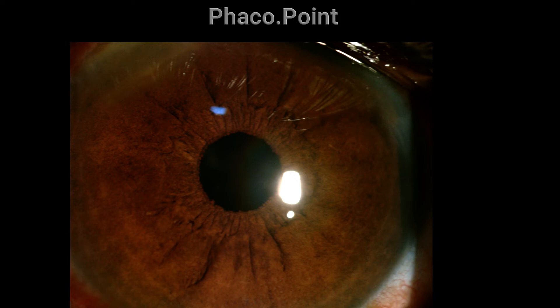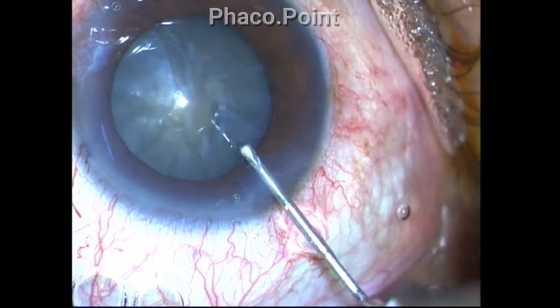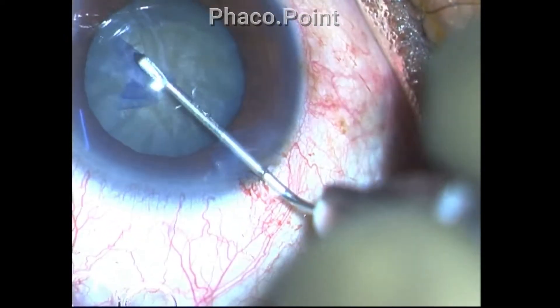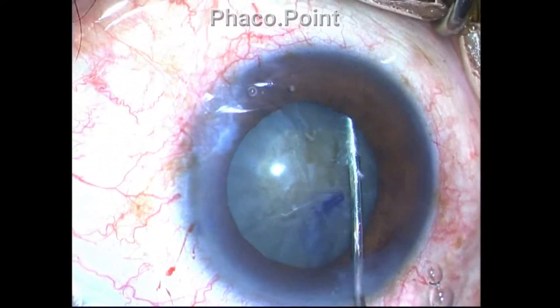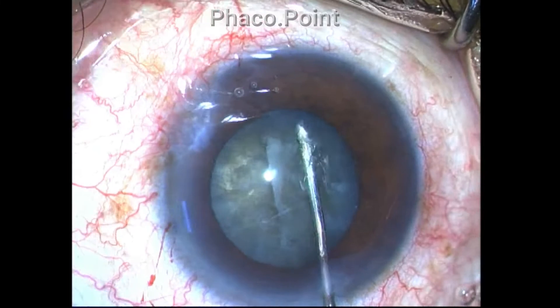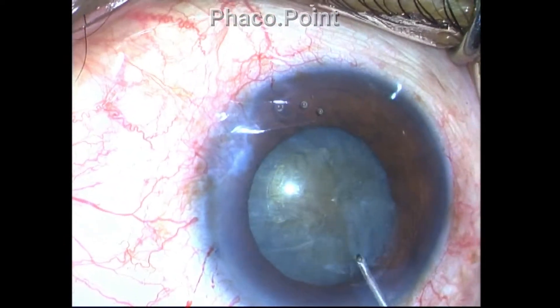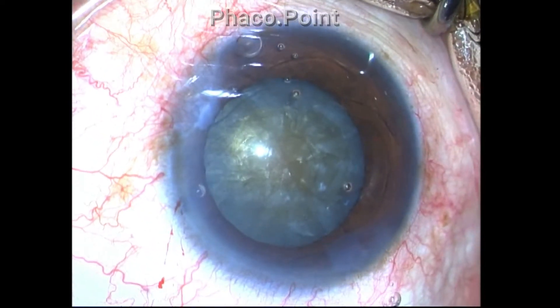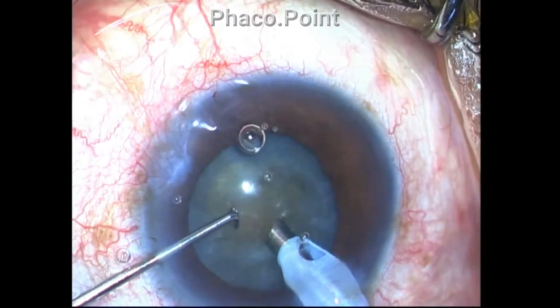Let's look at another example — a much harder cataract. The standard teaching is that for a grade 4 nuclear sclerotic cataract you should go for a larger rhexis size to help mobilize fragments; however, I recommend keeping your rhexis at the usual 5 to 5.25 millimeters because you are not going to mobilize large fragments. Mobilizing large nuclear fragments will cause multiple small nuclear fragments to form while downsizing, which can definitely be deleterious. In this case I will fill the anterior chamber with Viscoat to protect the endothelium, then mobilize the fragments one at a time.